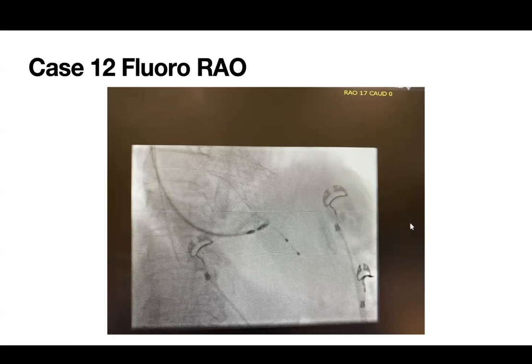So you're putting it at the 6th intercostal space? I'm putting it at the level of V3, at the height of V3, on the other side. Yep. Although in some patients, there's no difference. I tested it out in about 10 to 12 patients. In some patients, there's no difference, but in some cases like this one, there's a difference.